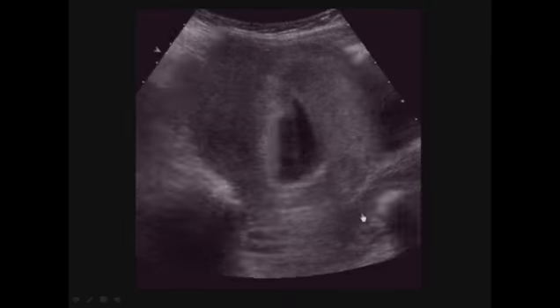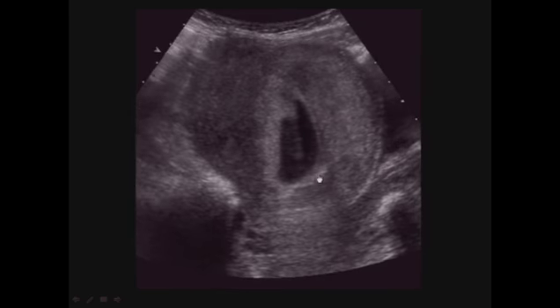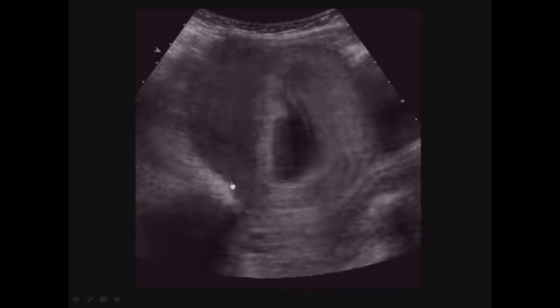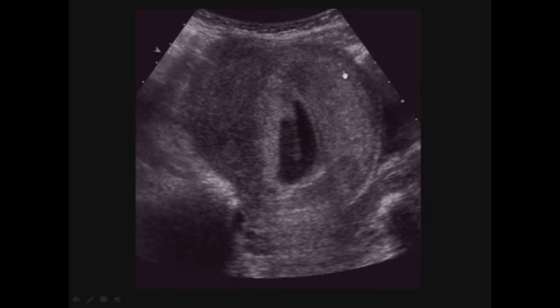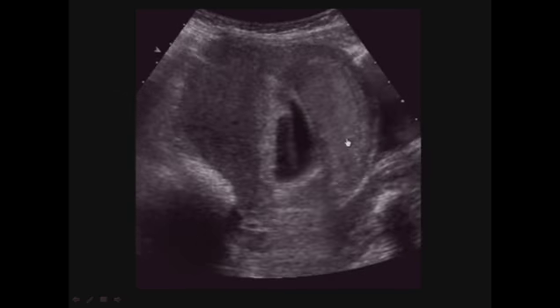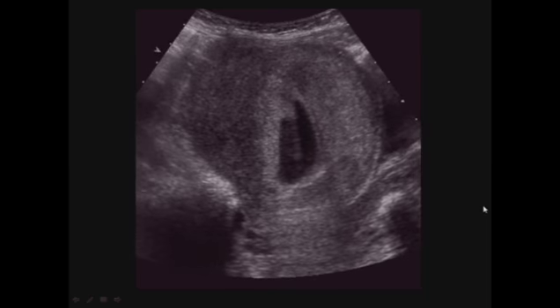Here's another patient. Here's the first trimester ultrasound, and you can see when we sort of jiggle the mom's abdomen, the placenta is back here, the uterine wall is here with a big contraction, and in the anterior aspect of the uterus, notice the jiggle that happens in this area because this is an isoechoic hemorrhage.